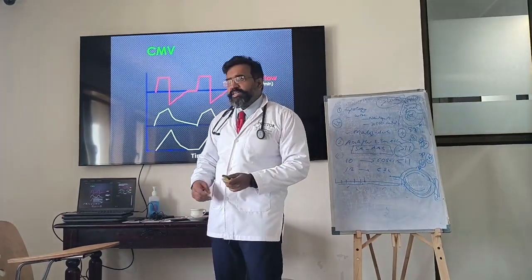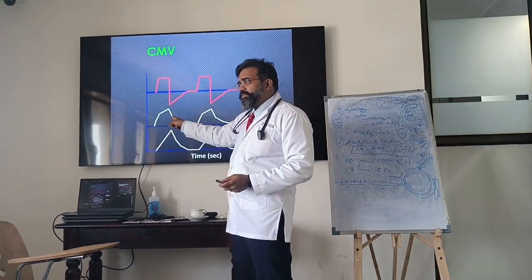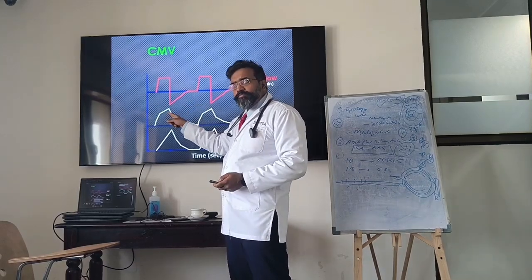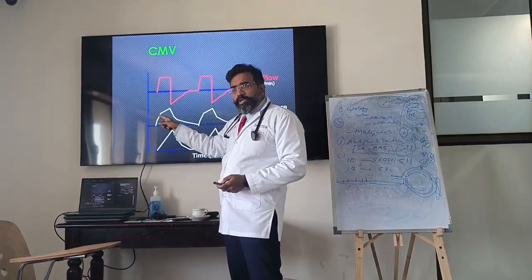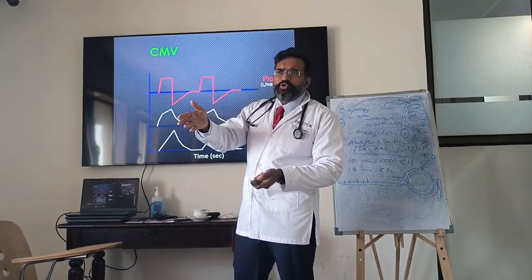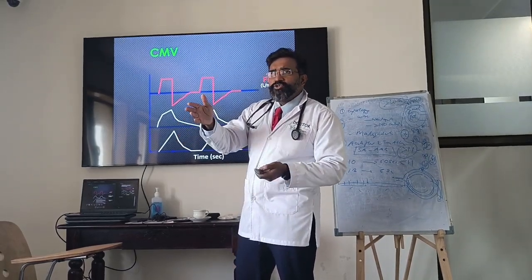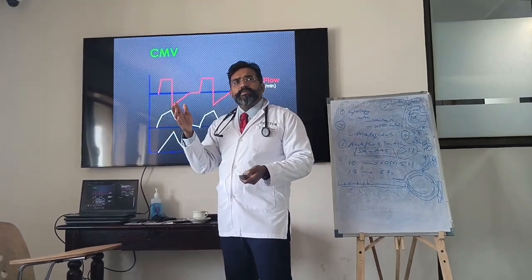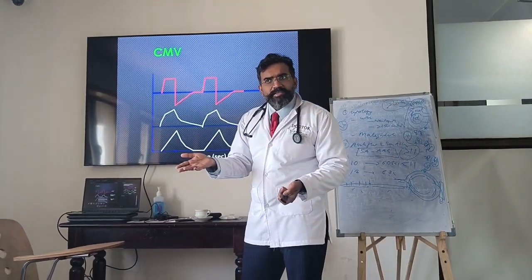So if I would see this is machine triggered breath, time that is. It is limited by volume. Okay, because I have dialed the dial, I told इतना में limit कर दो भाई. 300 अगर बोला तो 300 दो, उसके ऊपर 2 नहीं. ठीक है? And then I am cycling it with respect to time again.